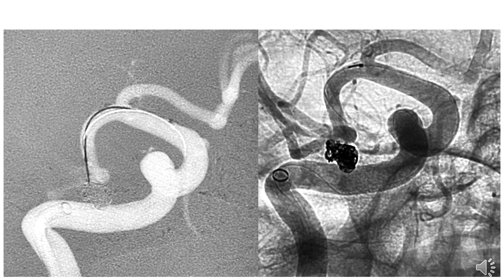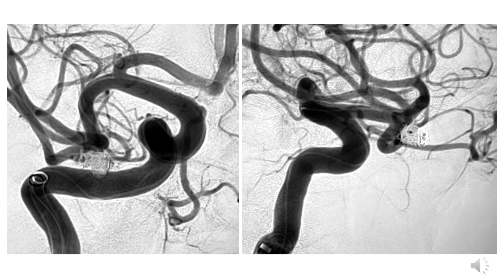We repositioned the microcatheter. We can see that the microcatheter has shifted slightly towards the right, and then we deposited some more coils towards the neck. This is the final control angiogram. The aneurysm is completely occluded now. We can still see that the mesh of the coil will allow some contrast. It is not a very dense mesh. It is occupying most of the aneurysm, but we know that it is going to recur.